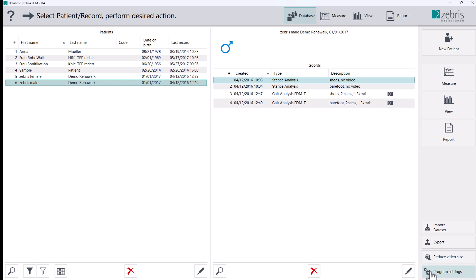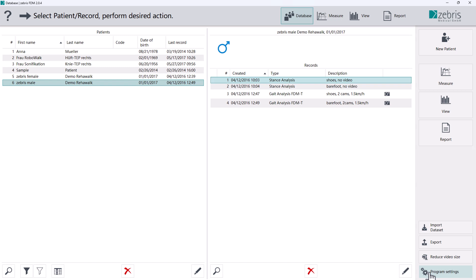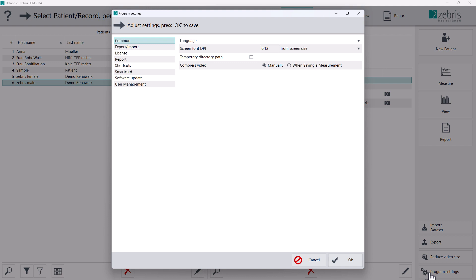In the program settings, you can also choose to automatically compress the video material whenever a record is saved. Click on the program settings button at the bottom right. A new window opens.